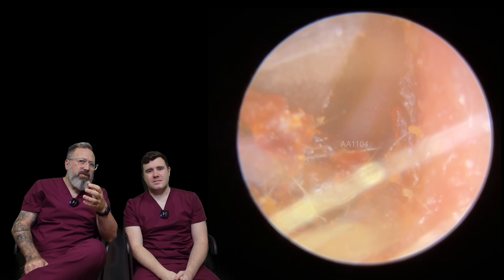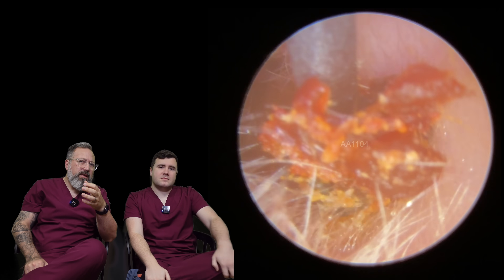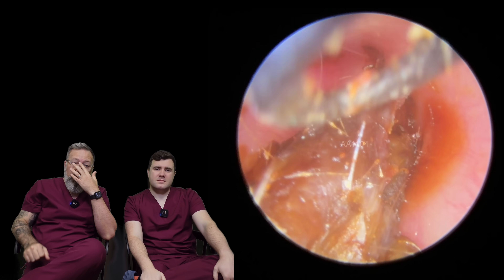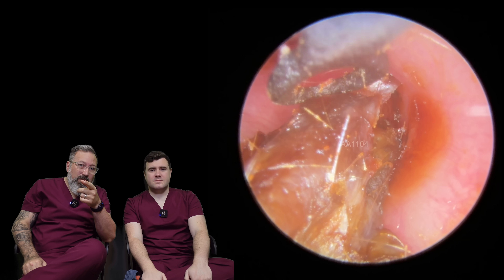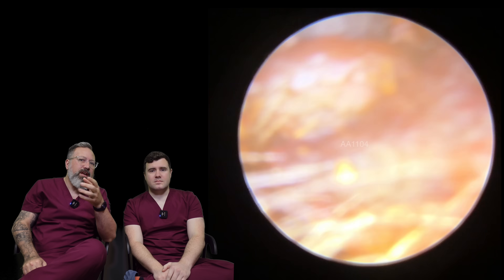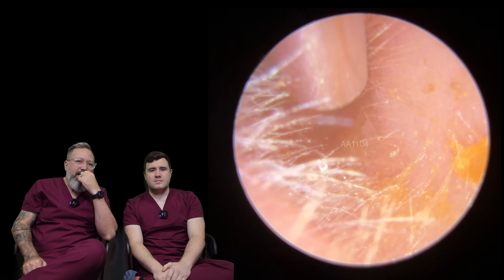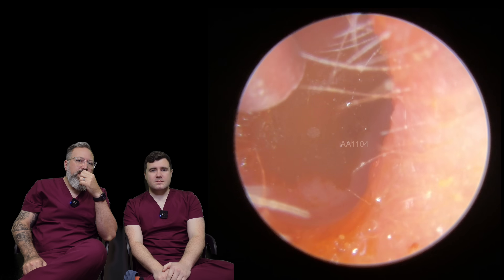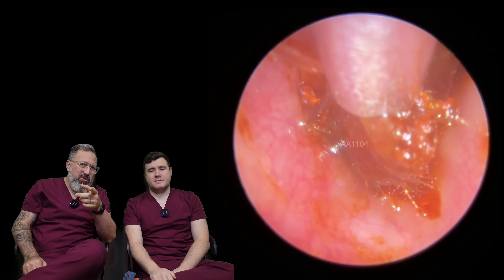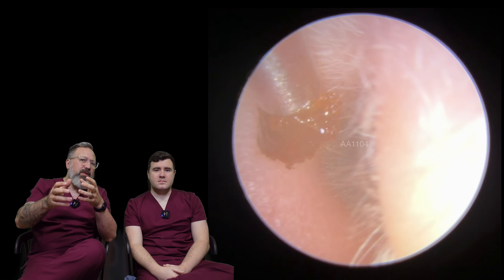And it's drawing down — you can see we're pulling this away. But it's kind of an odd consistency; it's a really dry sort of wax. And I can almost see the back end, but I don't want to go that deep. I just want to take away this front section, so I'm going to get all this away. Then we're going to put a little bit of olive oil in there. The oil's gone in. It is so deep — I just peeled that one section off the side of the canal wall.